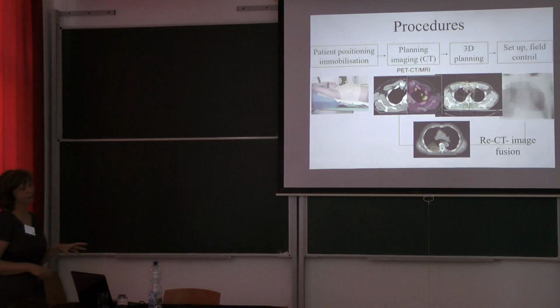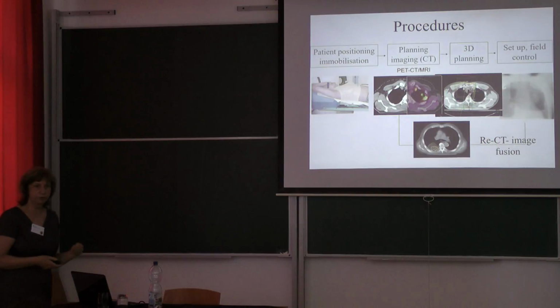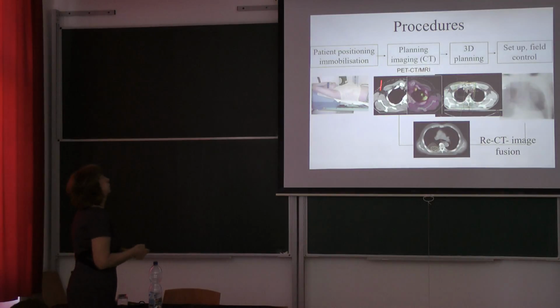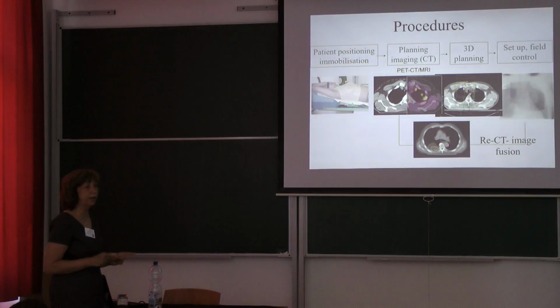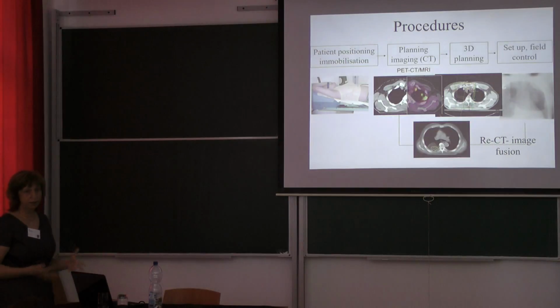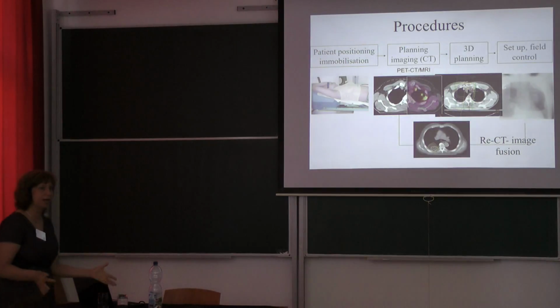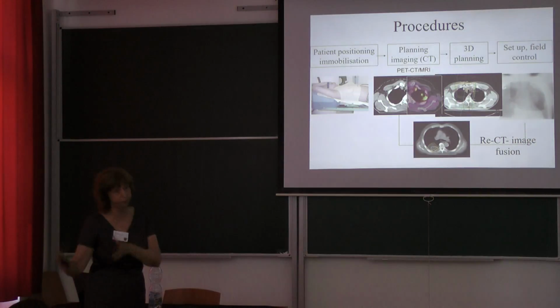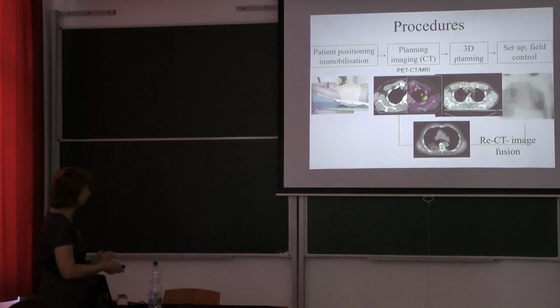And of course, this is an unnatural position to lay down like this, but we have to make all of our efforts to be as convenient as possible, otherwise the patient will move to try to get rid of the inconvenience. So this is the patient positioning, which should be applied already for the imaging for radiotherapy planning. And the immobilization, the different types of immobilization, is used to get a better reproducibility and to stabilize this position, both for the intrafractional radiation delivery and for the repeated repositioning between fractions.